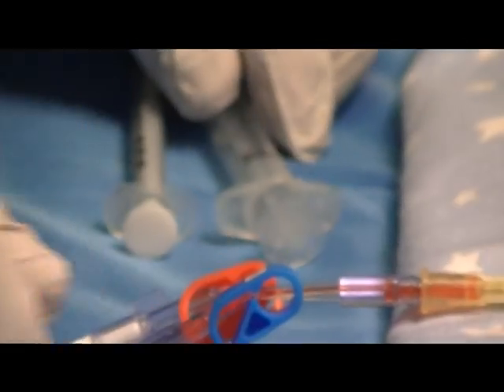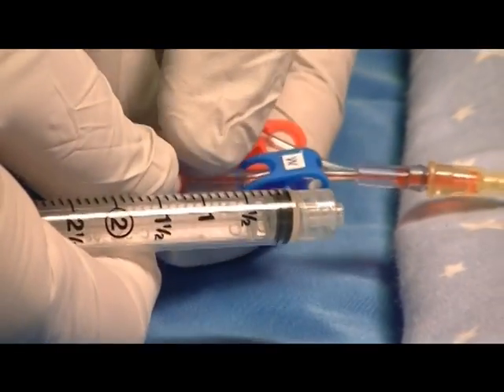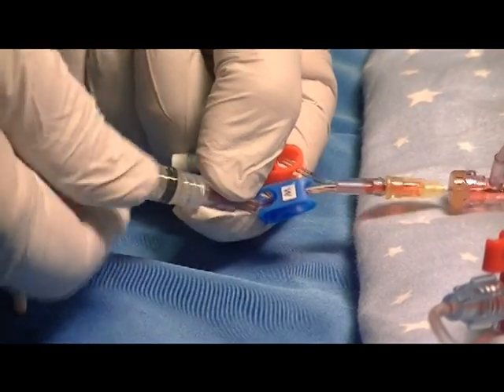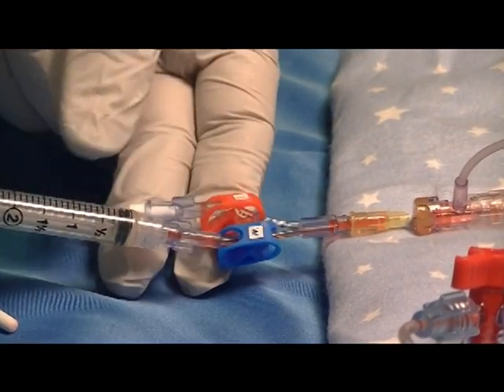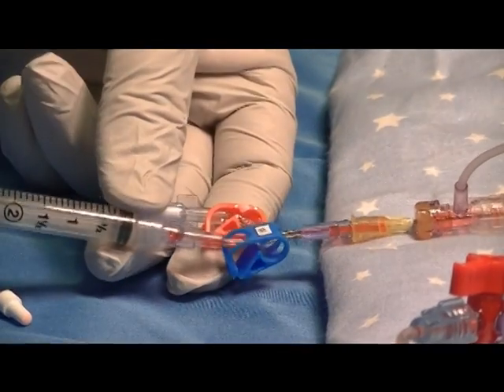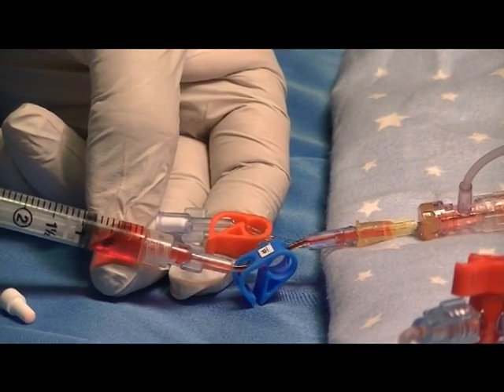Re-clamp the waist clamp and attach the 3ml aspirating syringe to the waist side. At this point, draw 0.5ml of clearance blood into the waist syringe.